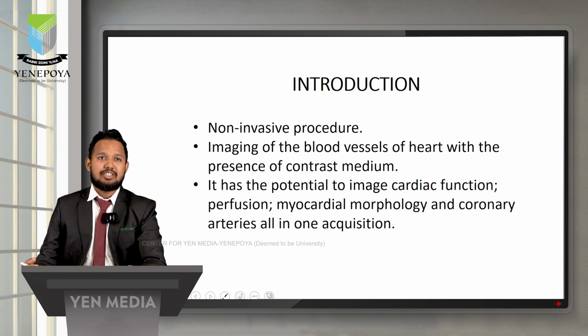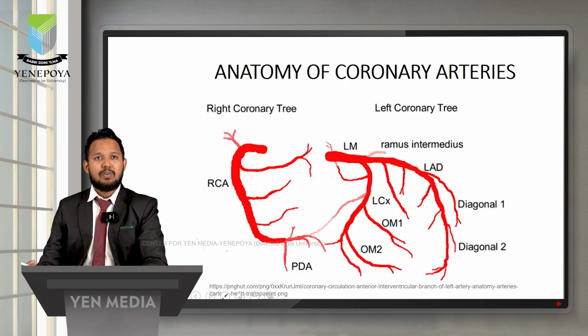So what is coronary angiogram? Coronary angiogram is a non-invasive procedure in which we inject the contrast media into the blood vessels and we visualize the blood vessels of the heart. This study has the ability to image the cardiac function, perfusion, myocardial morphology and coronary arteries in a single acquisition. So we shall go and see the vessels of the heart now.